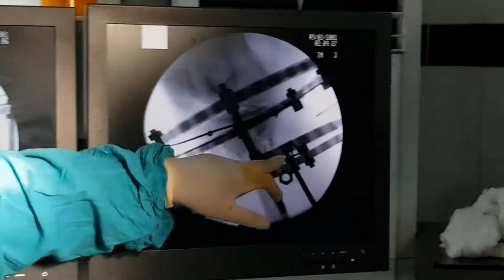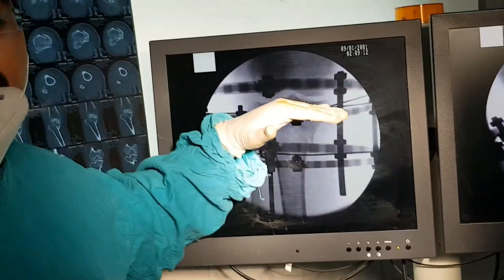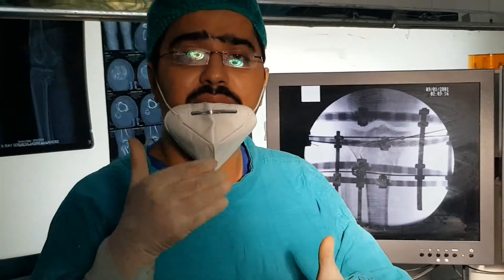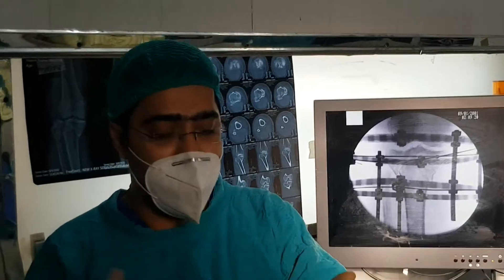This is the AP view. This is the lateral view. There was a posteromedial segment that we addressed. Ultimately, we have achieved 100% articular surface restoration. This technique has many advantages — we mobilized the patient on the very next day. Thank you very much.